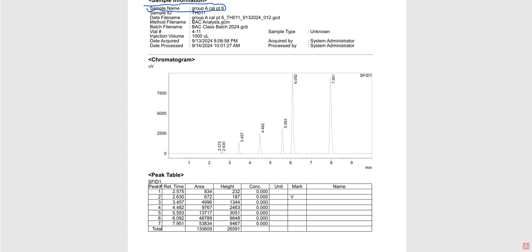Was this a sample? We ran 5 blood samples. If so, was it sample 1, 2, 3, 4, and 5? Was it a duplicate? Was it the A or the B version? That's how we name these. So that is how you're going to determine which one is which in the report batch that we give you for the analysis piece. So that's going to be the very first thing I want you to focus on.